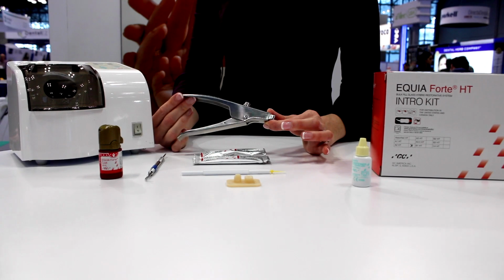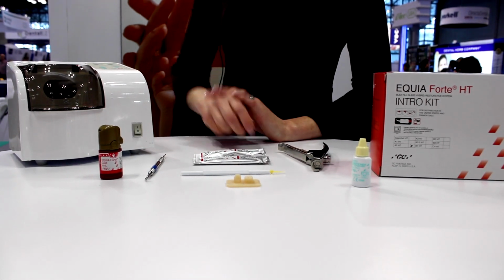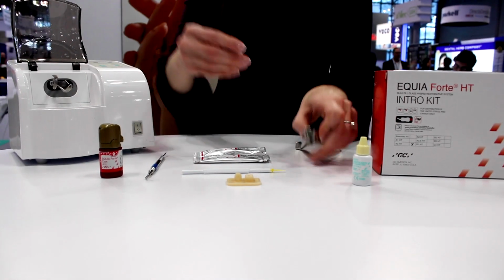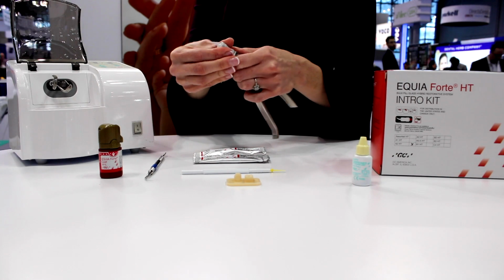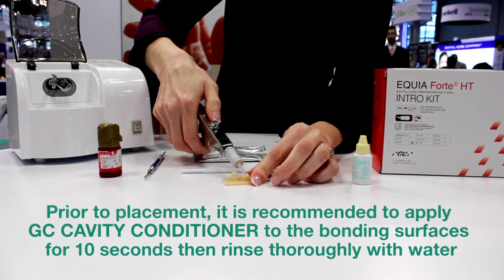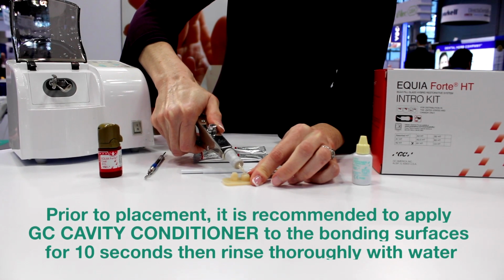While you're waiting through the 10 seconds, you're going to get your capsule applier ready to go. Remove, and you're going to place 3 clicks. You're going to place into your restoration.